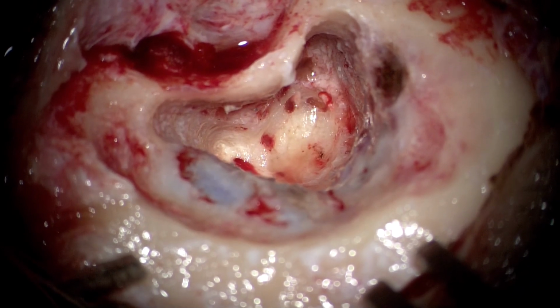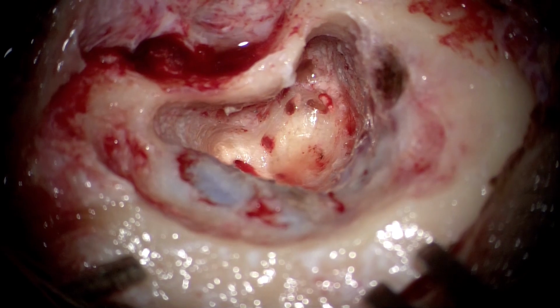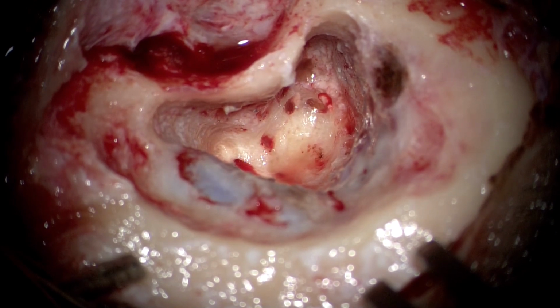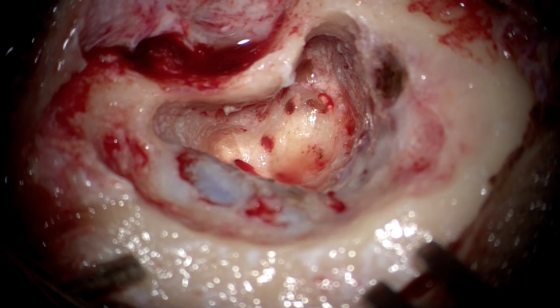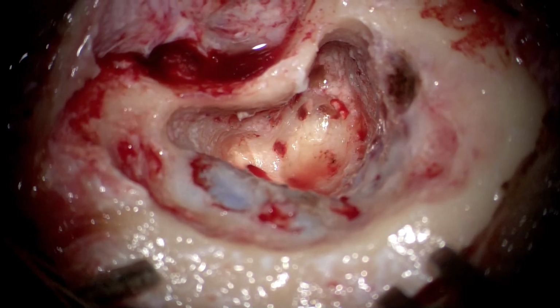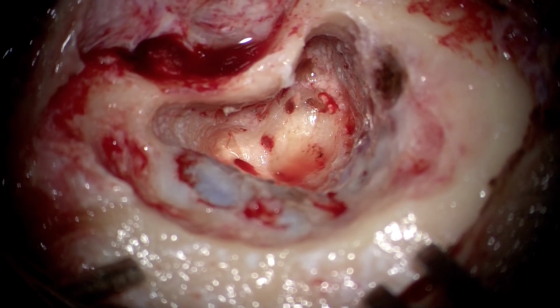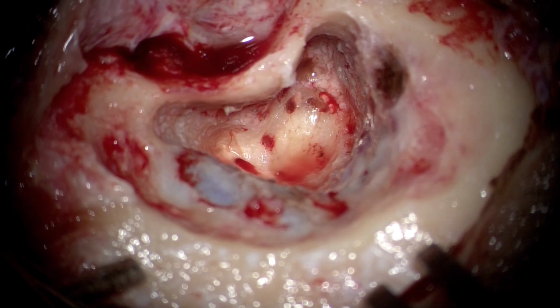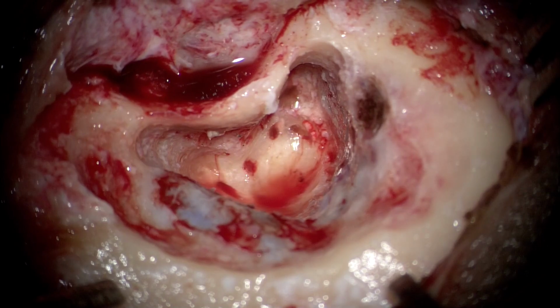We do not want to be crossing the superior canal ampulla anteriorly or superiorly, because if we go superior or anterior towards the superior canal ampulla and we drill medially, then we risk causing damage to the labyrinthine segment of the facial nerve, which lies immediately underneath the ampulla of the superior semicircular canal. The labyrinthine segment of the facial nerve also happens to be the most fragile and thin segment of the facial nerve, and is particularly amenable to injury.